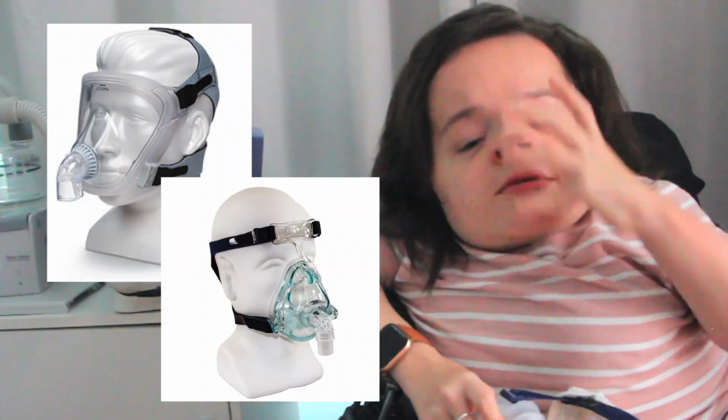I did because I wanted to get out of there. I was inpatient for almost 2 months. I started using it, and that's when we discovered there are different masks and things like that. Because the only one that I had ever tried when I finally got diagnosed was the full face mask, and that terrified me. I hated it. I felt like I was suffocating myself.